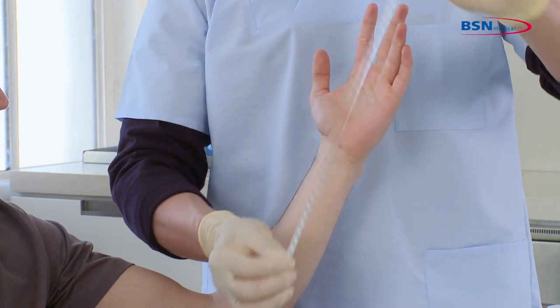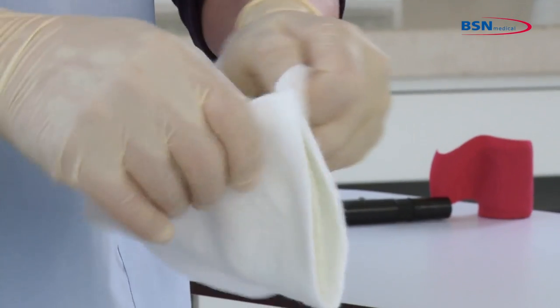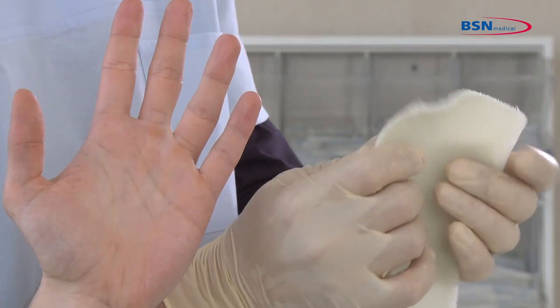Then cut the desired length of the splint. You can open the padding completely. If you use a bucket of water or faucet for water activation, you do not need to open it.